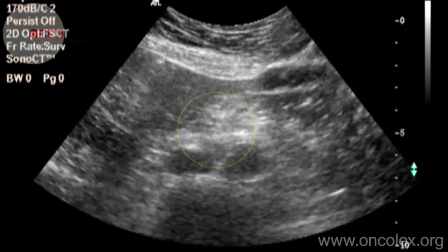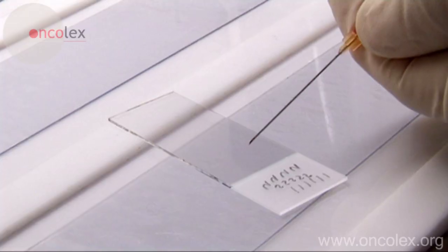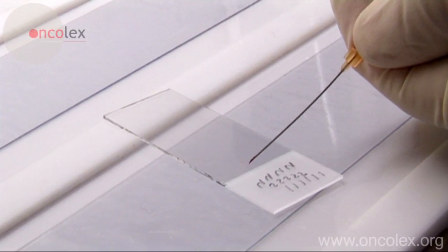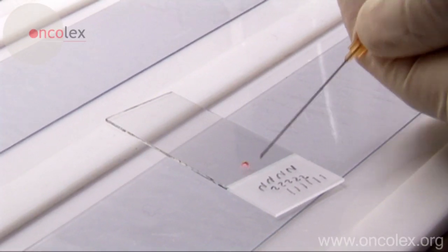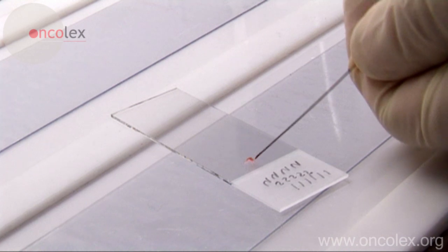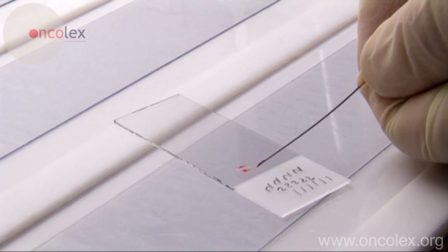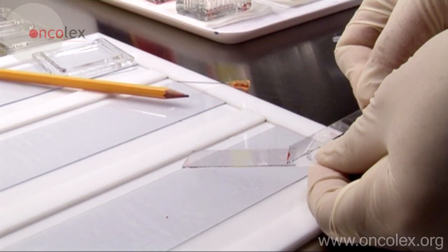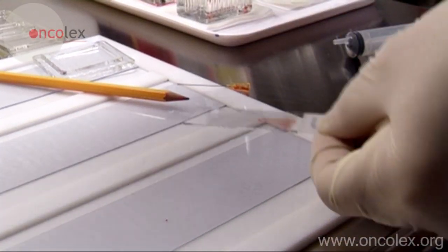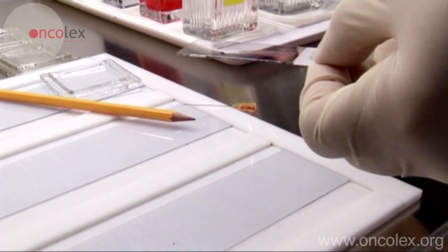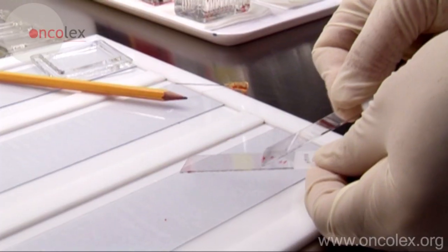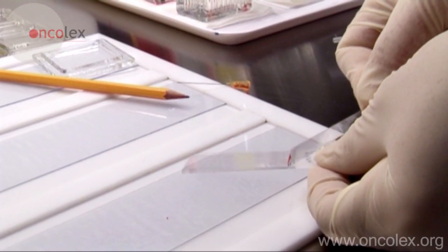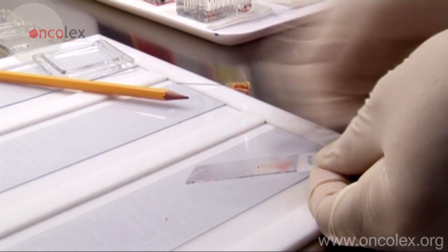After the biopsy, the material is carefully placed on a slide. Another slide is used to smear the material. The material is collected with the slide and then smeared with one rapid, forthright movement.